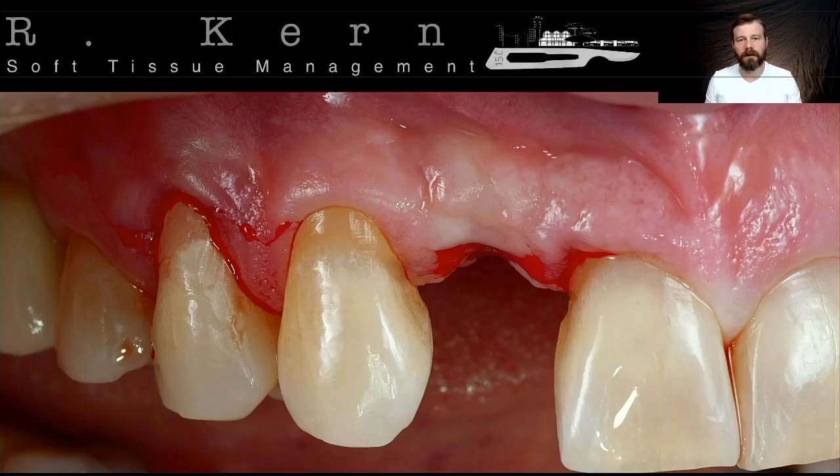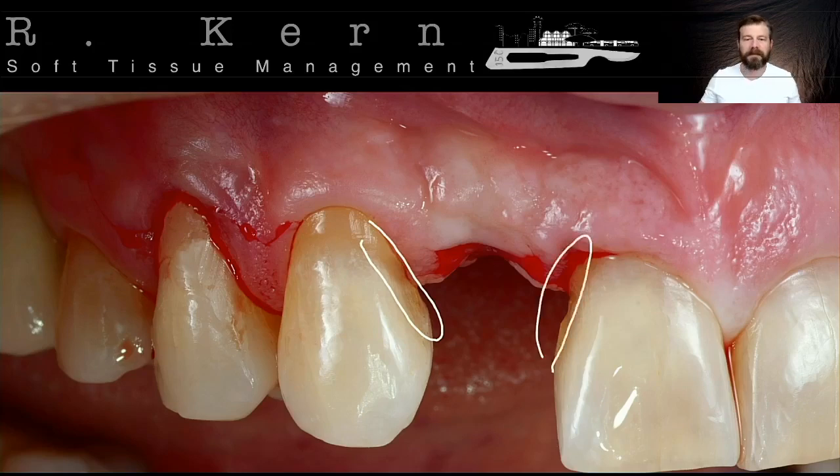In a case like this one, my challenge here is to build up tissue on this area, the papillas, and a connective tissue really struggles to be maintained on this papilla, mainly because of the nourishment. And if I use a pedicle, the connective tissue on this pedicle usually is more stable, okay? During the healing, it maintains the volume that you grafted.